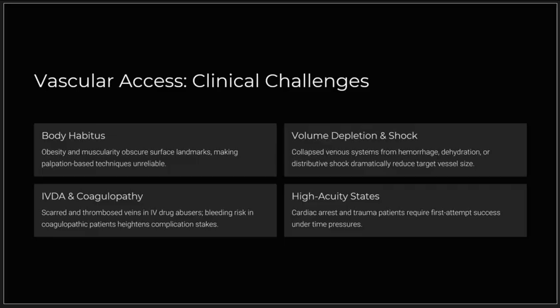We have patients that might have a history of IV drug abuse, where those vessels become scarred or even thrombosed. So it's important to use ultrasound to look and identify an appropriate blood vessel rather than accidentally cannulate a blood vessel that might have a thrombosis within it.